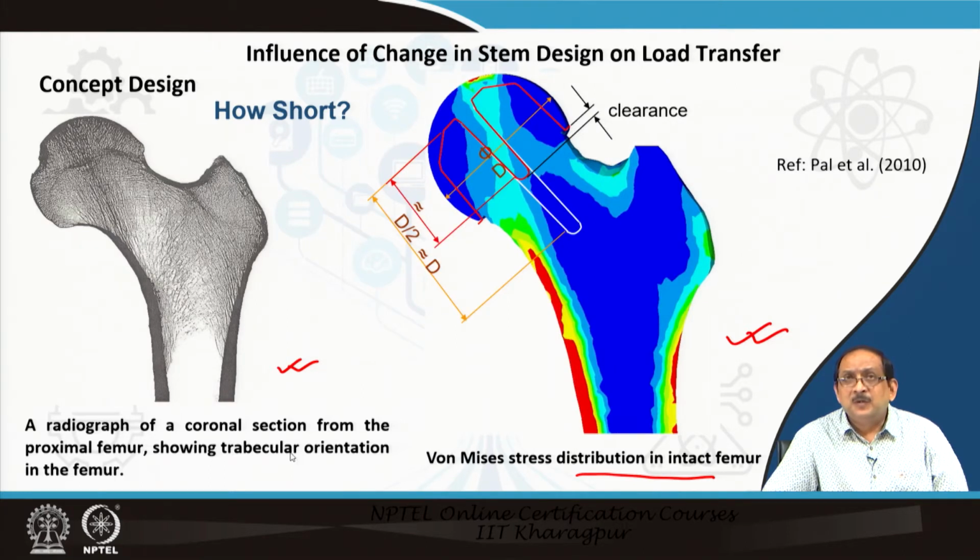As you can see, the stem length in the revised design has been reduced to half of the original length, and it is approximately equal to the diameter of the resurfacing implant.